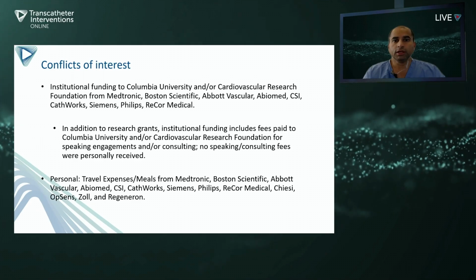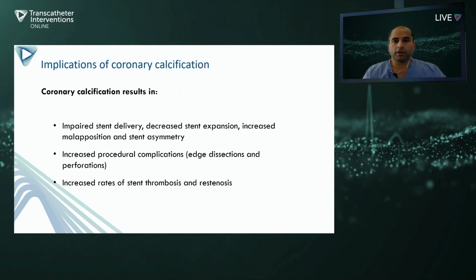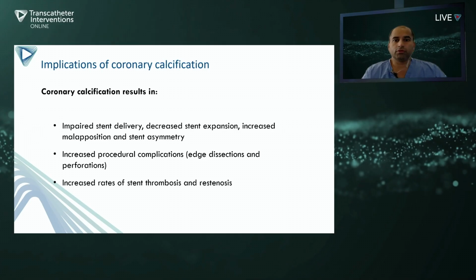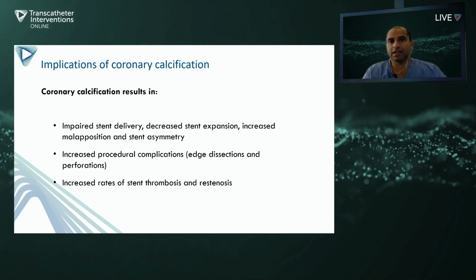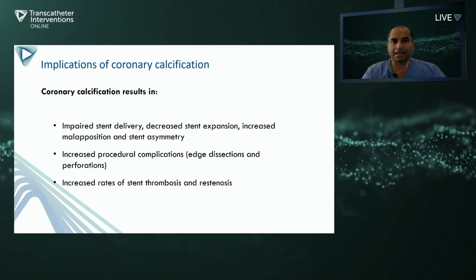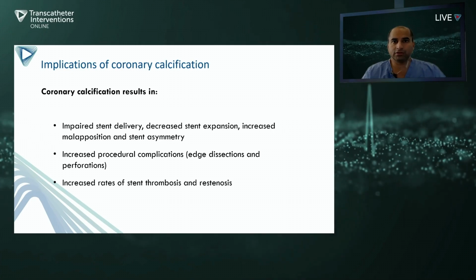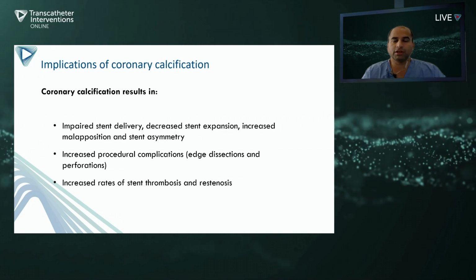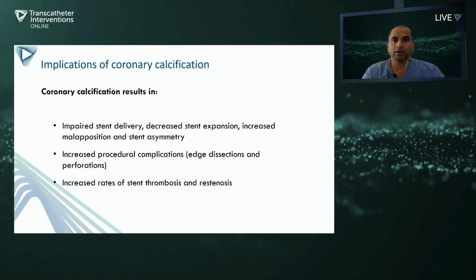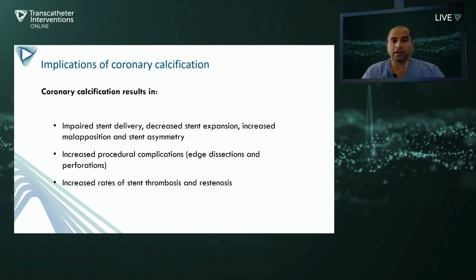full disclosure. To start off with, we covered this already, but it's really important that interventionalists recognize that it's not just getting the stent to the location, it's a combination of getting the stent to where it needs to be, but then also expanding it adequately, because so many of our trainees focus on getting it to where it needs to go, but if you don't expand it, then that's going to have bad outcomes.